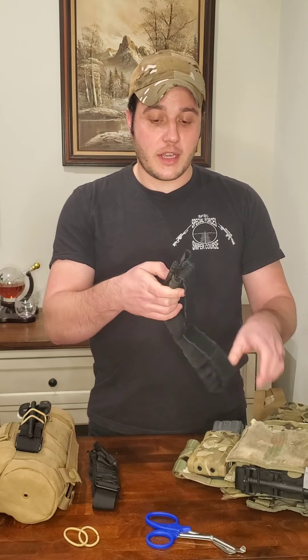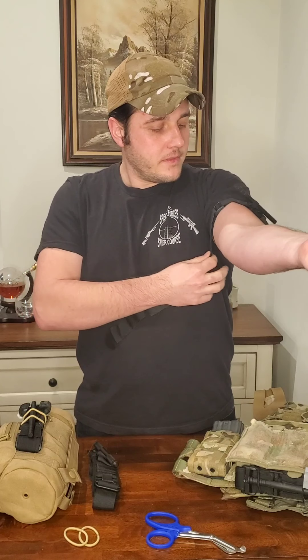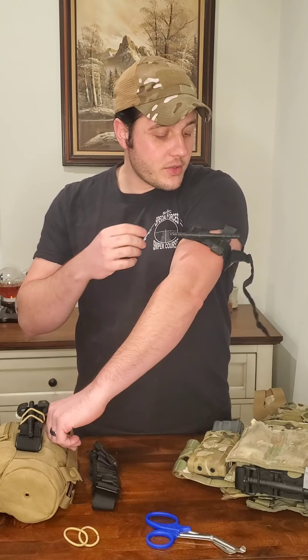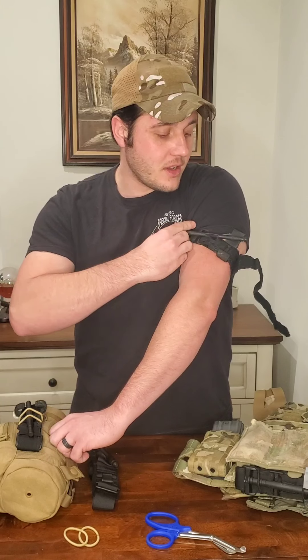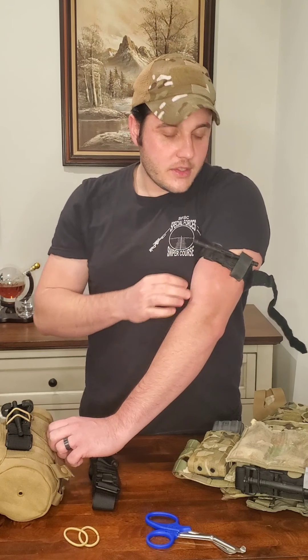Take your tourniquet, slide it over the extremity, grab your running end and tighten it down. Rule of thumb for tourniquets: above the wound, closer to the heart — we always preach high and tight, meaning as high up on the limb as you can get it and as tight as you can get it. Once you have the tourniquet attached with the Velcro secured, take this plastic tube called a windlass and twist it until the tourniquet is tight. Once it's tight, lock it into the little U-shaped channel, then take the Velcro and secure it over the top.